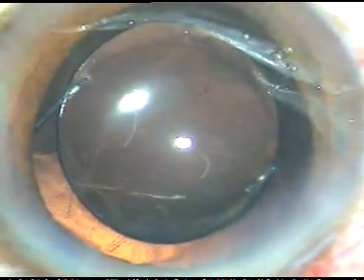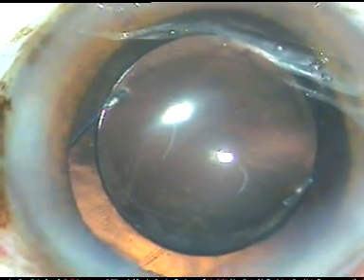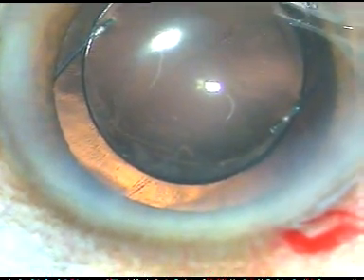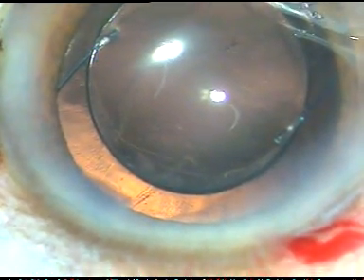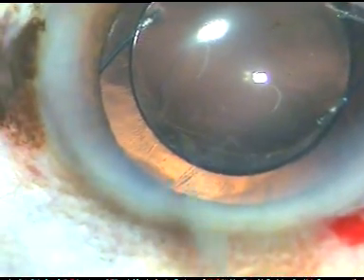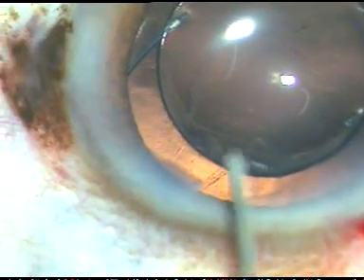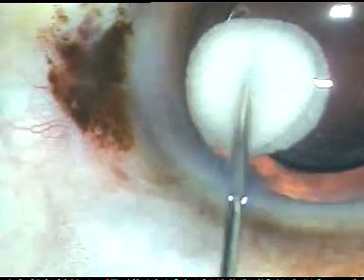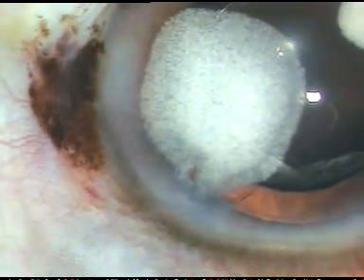And it appears fine now. So the case is nicely done. Now I am going to confirm that there is no vitreous in the anterior chamber. I inject a bit of triamcinolone acetonide at two or three points.